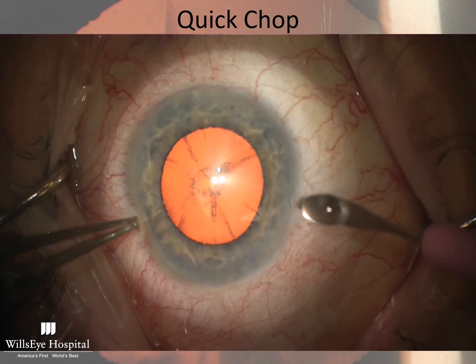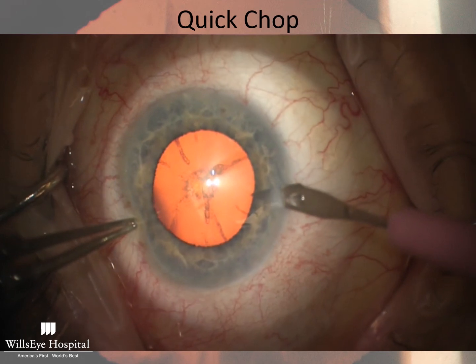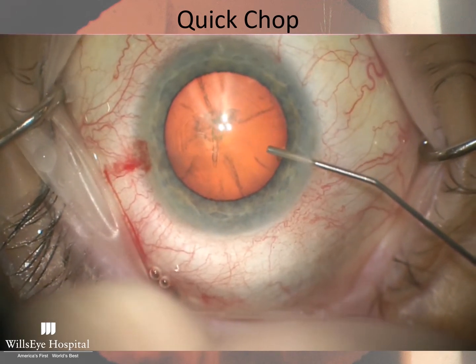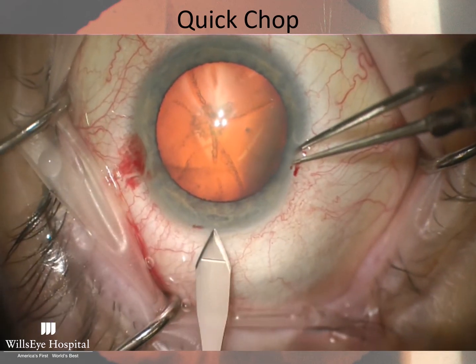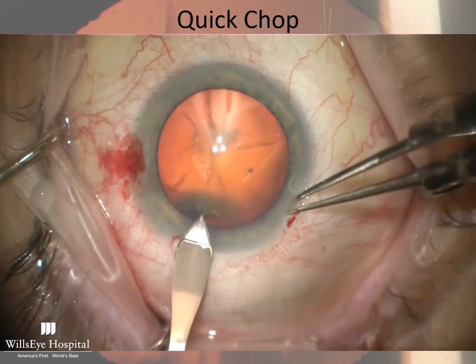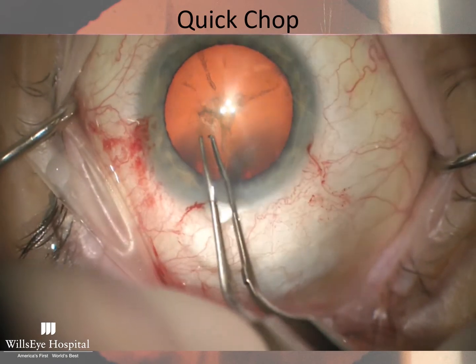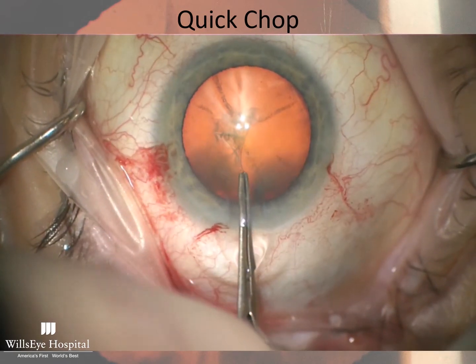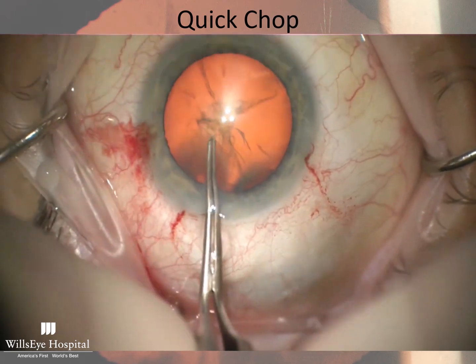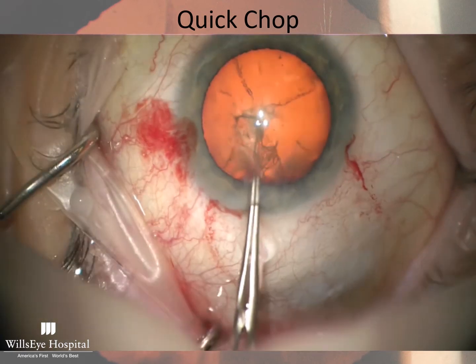Here is a video of quick chop technique. This is sped up. We'll go through the steps again. Viscoelastic going in the eye. Here I'm doing that triplanar wound with the edge of the keratome. I just feel it helps to set my depth and wound appropriately. Pivoting in the wound, twisting in the wound, not driving up against the side of the wound to get past the subincisional area with my capsulorhexis.